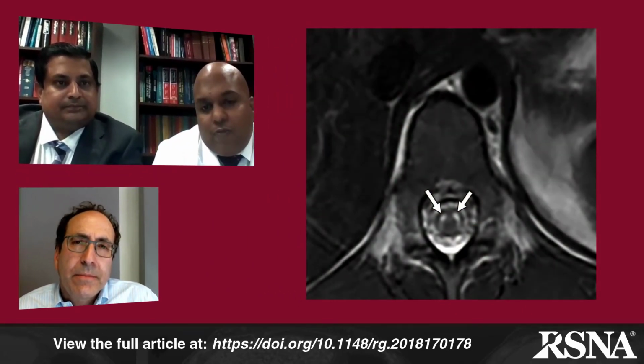Sure. I'm just going to describe Figure 12 now. Yes. So Figure 12 is an axial T2-weighted MR image through the thoracic spine. You can see here that there's an abnormal hyperintense signal within the ventral aspect of the cord with an appearance resembling owl's eyes or snake eyes. That appearance is due to preferential involvement of the anterior horn motor neurons. The ventral part of the cord has its main blood supply from the anterior spinal artery, which is a single artery without good collateral blood supply.